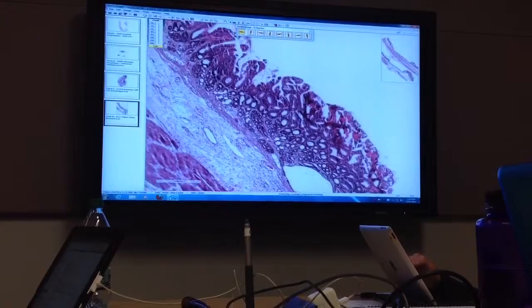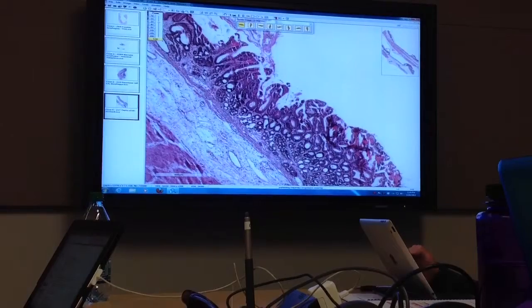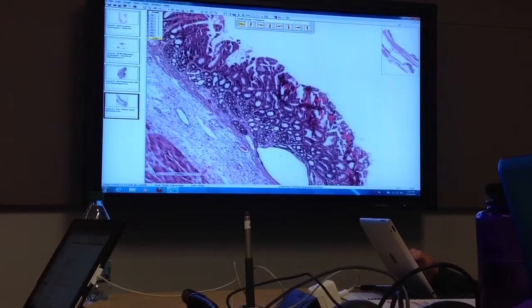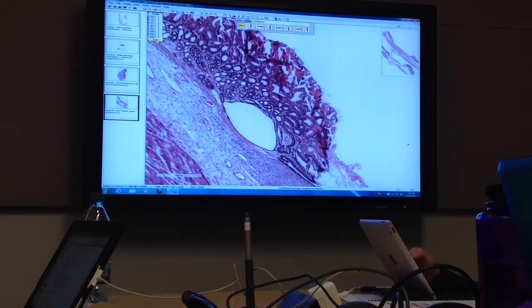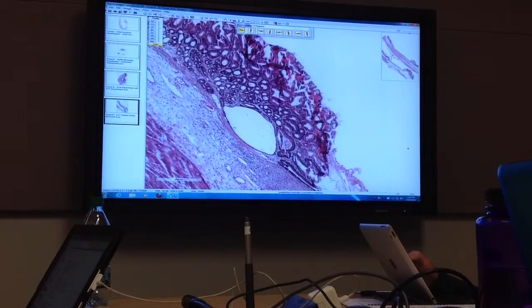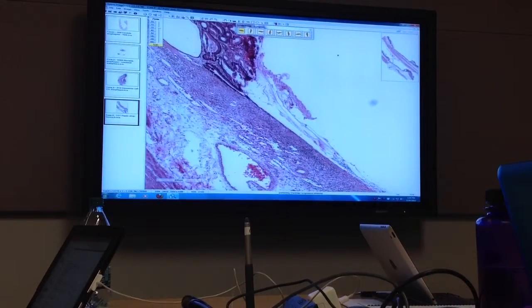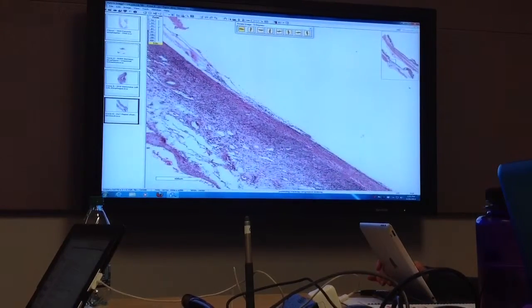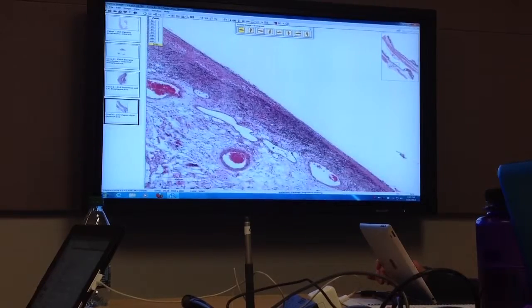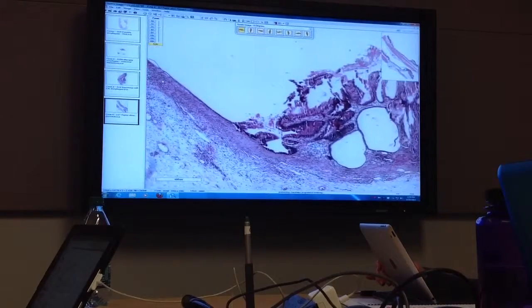Okay. Does anybody know where we are? Okay. Yeah, we're in the stomach. So this is the surface foveolar epithelium. Here are the little glands of the stomach. This is some fresh hemorrhage that may be procedural due to the removal of this portion of the stomach. Here's a little cystically dilated gland, which is probably a reactive process. But look here. All of a sudden, everything is gone, right? There's nothing there. It's just gone. And if we keep going and going, it's a very long kind of ulcer, right? Okay, it goes on forever, it seems. And then here's the other edge.